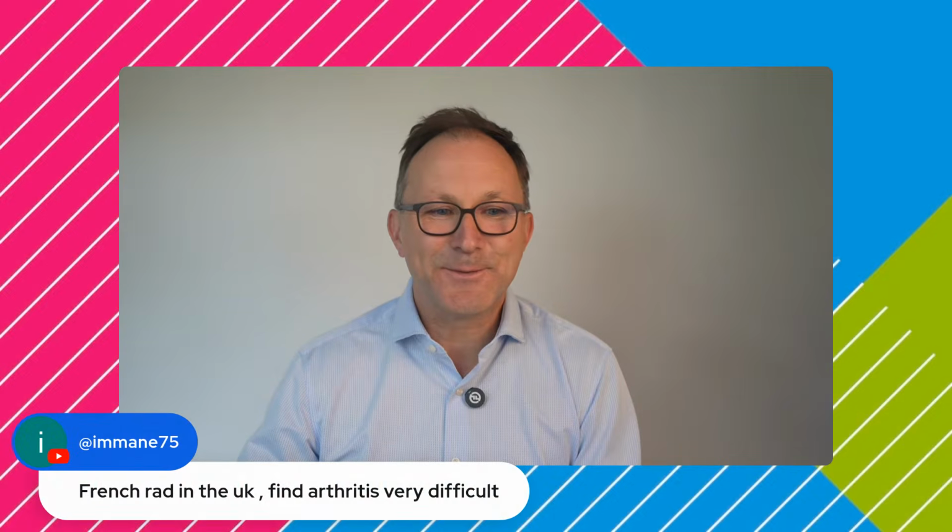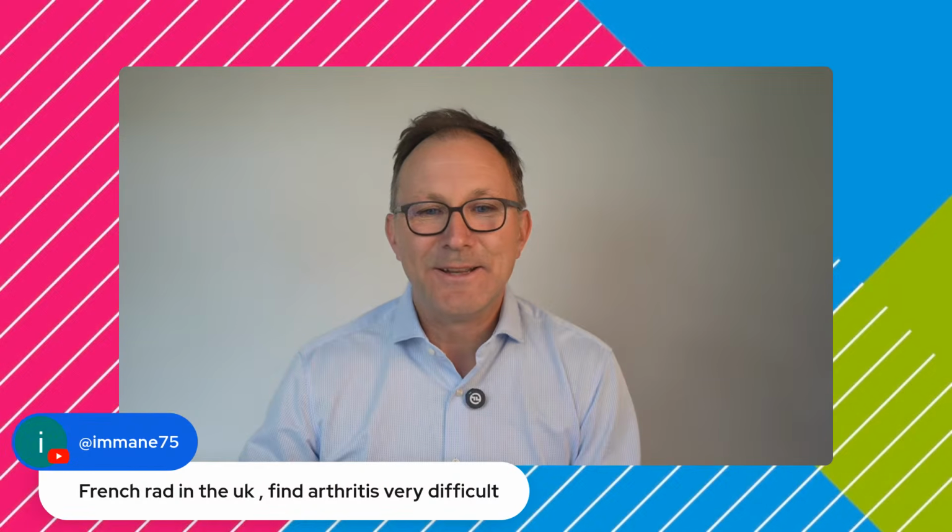So I will have, let's say, 10 minutes, maybe 12, of prepared slides that bring you an introduction to arthritis imaging. And then we also have cases that I will present, that you can enter and try to solve with our interactive platform. Arthritis is difficult, that's for sure. So we are doing it on a regular basis. So hopefully we can bring some of the arthritis imaging spirit over to you today.